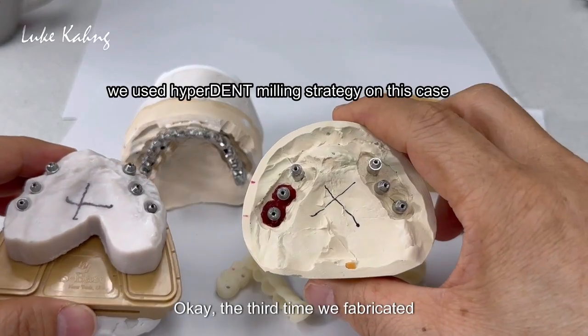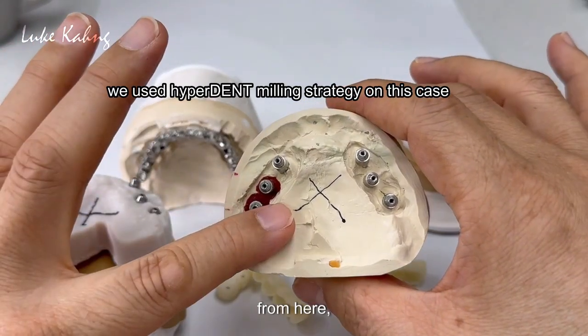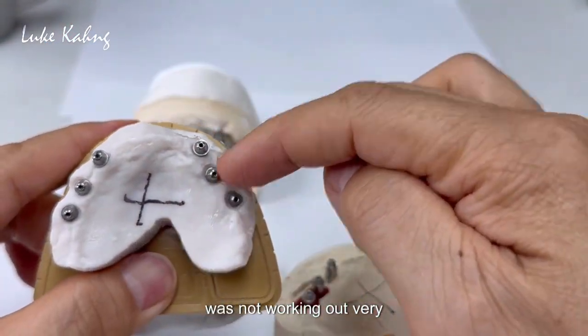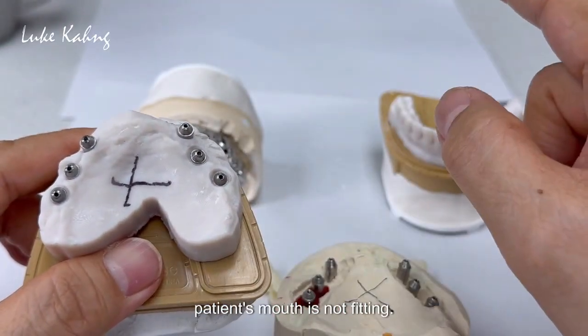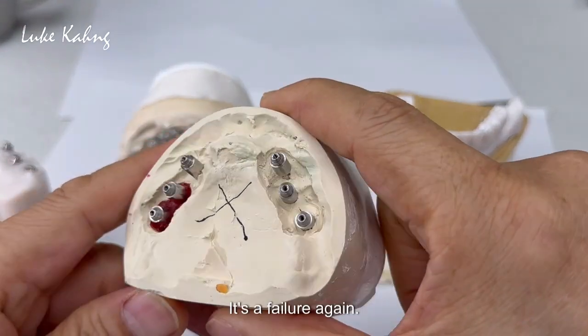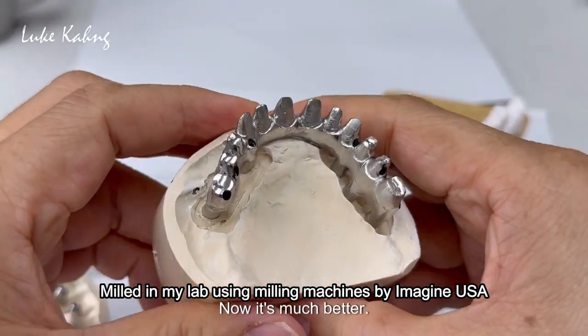The third time we fabricated — actually from here, the digital was not working out very good. Our model was good but in the trial the patient's mouth is not fitting. Doctor did this one. It's a failure again. Now the third one — we changed it. Now it's much better.